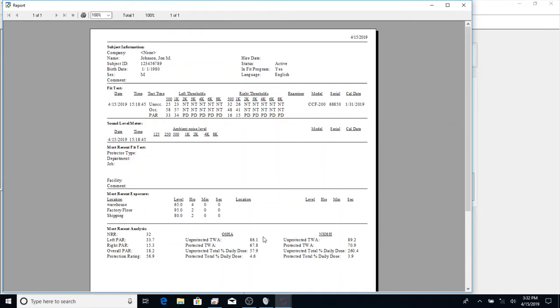If we go to the right, we can see the OSHA and NIOSH values. This lets you know what percentage of noise the worker has been exposed to, given their exposures and the protection rating.